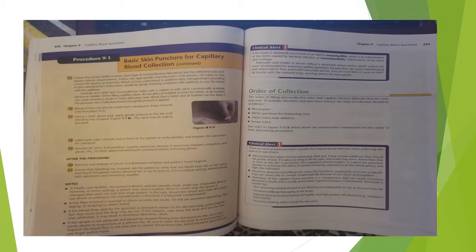Clinical alert. There are several pre-examination variables that require special attention when collecting skin puncture specimens. Microcollection tubes must be adequately filled, and if they contain additives, they should be gently mixed. If it takes too long to fill the tube, microclots may form. Remember that as soon as the skin is punctured, the coagulation process begins, so collect the specimen quickly to minimize the effects of platelet clumping, exposure to air, and light. Excessive amounts of overfilling can cause clot formation. Inadequate amounts or underfilling can cause cells to change morphologically because of too much anticoagulant.